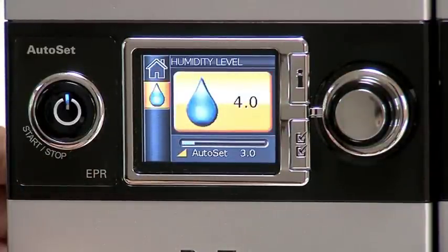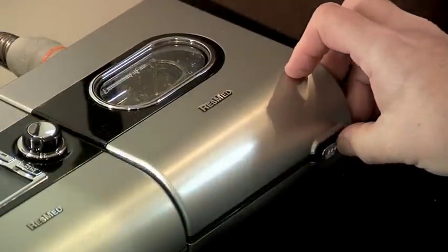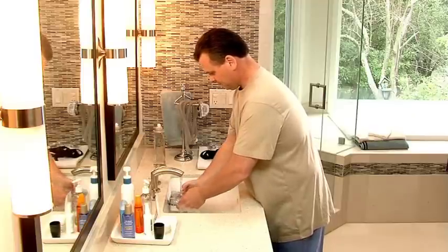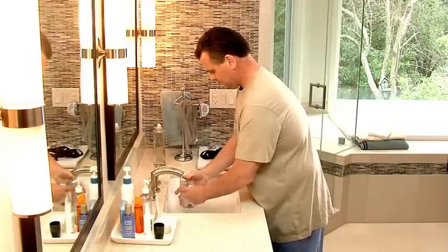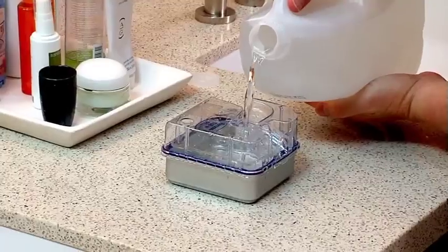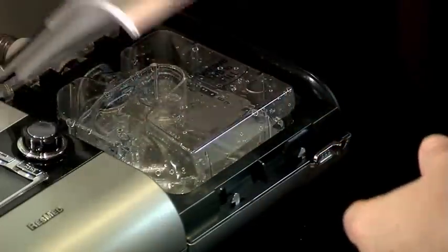Maintaining your humidification system is just as important as maintaining the device itself. On a daily basis, slide the latch on your humidifier unit and lift open the flip lid to remove the water tub. Wash the water tub in warm water using a mild detergent. Next, rinse thoroughly in clean water and allow it to dry away from direct sunlight. Before you use it again, fill the water tub with distilled water, return it to the humidifier, and close the lid.